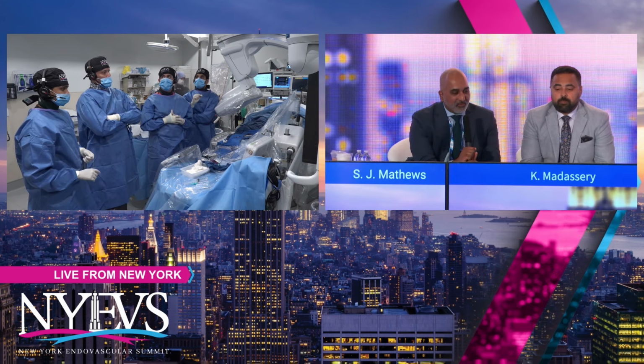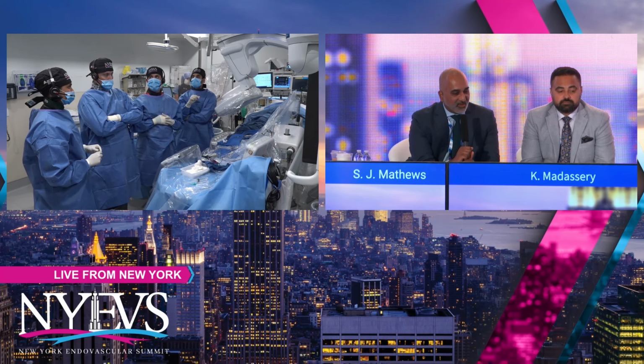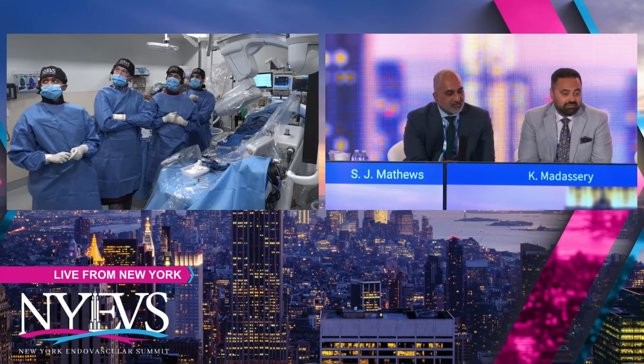I agree. If we had put a long covered stent in, I think this could have turned into an ALI situation down the road. So I think this is probably the best solution we have right now. Great job, guys. Despite all odds, you did a fantastic job, and it looks great.